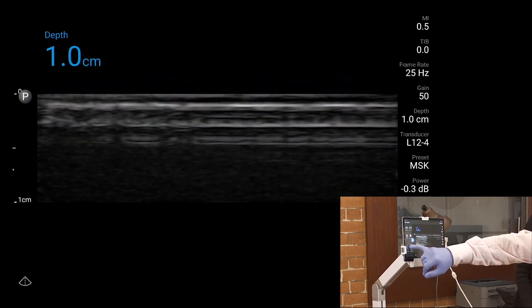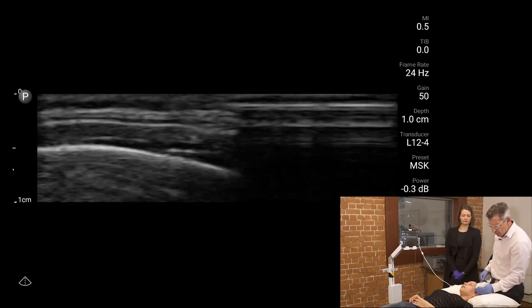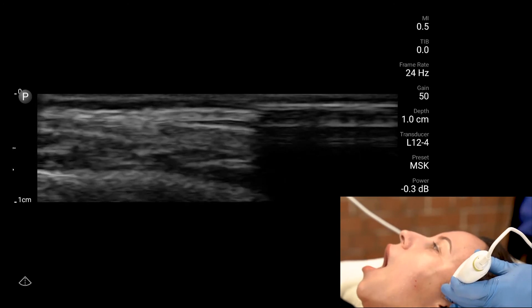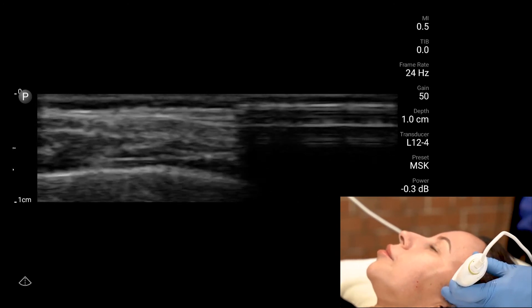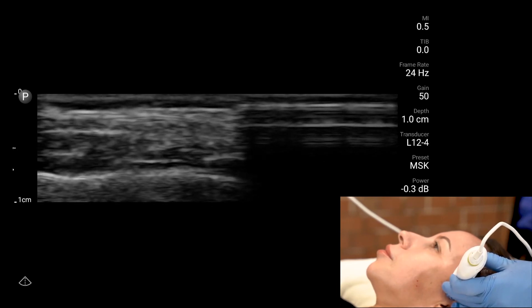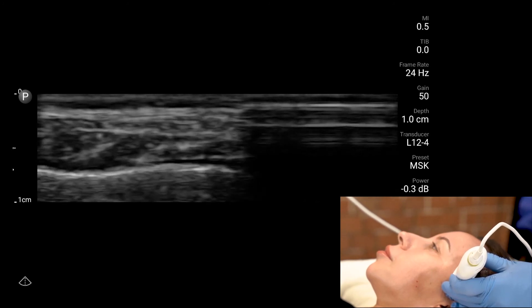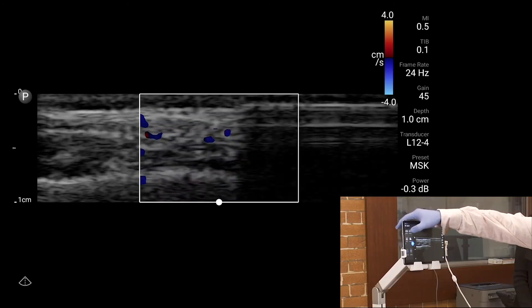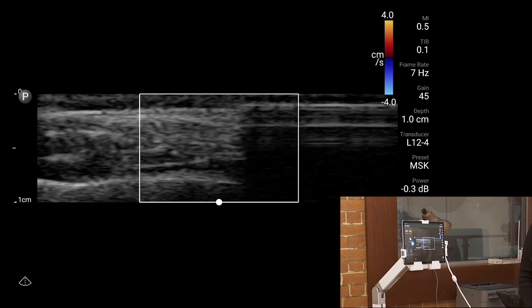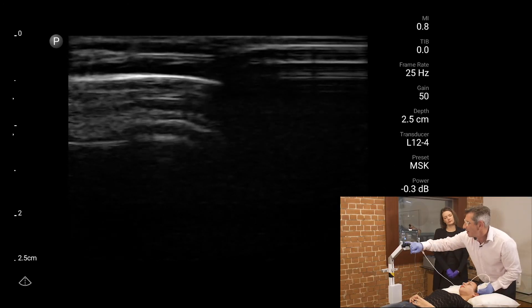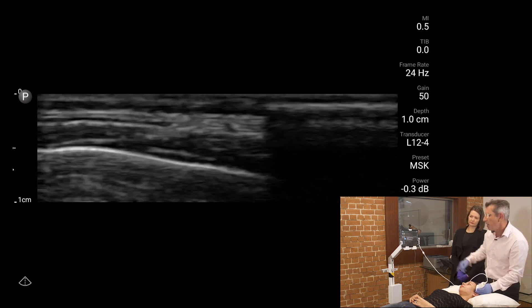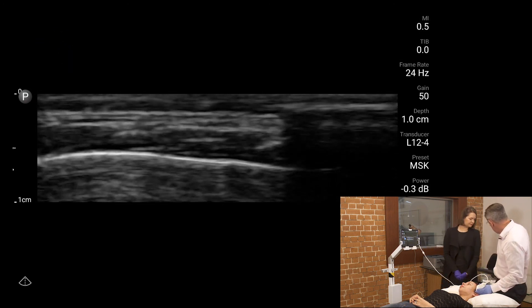I can magnify this with this device, which will give us a better picture. The other thing I like about this device is if I'm injecting an area where I might be concerned about an artery — such as the temporal artery — I can check using Doppler and adjust the depth to get a nice field of view sitting immediately above her skull. That's her temporalis muscle.